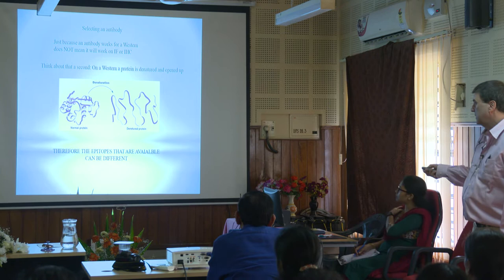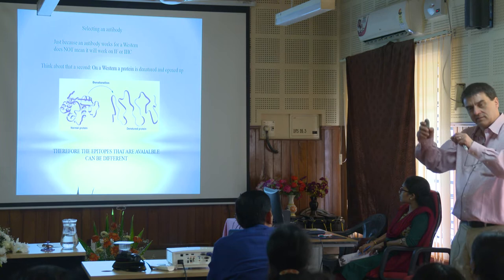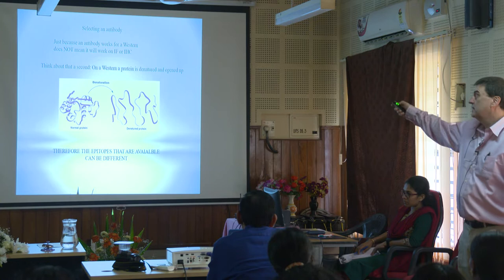Okay, so by denaturing or not denaturing or, you know, leaving it in a native form, different epitopes are available. It can be different. So take-home message, one antibody doesn't necessarily work for all techniques, and one antibody isn't going to recognize all the different species either, okay? But like I said, a lot of these things have been tested, a lot of these things have been figured out, so take advantage of that.